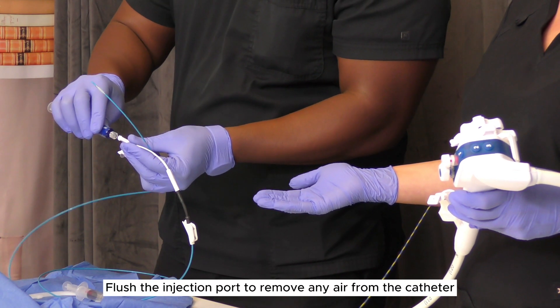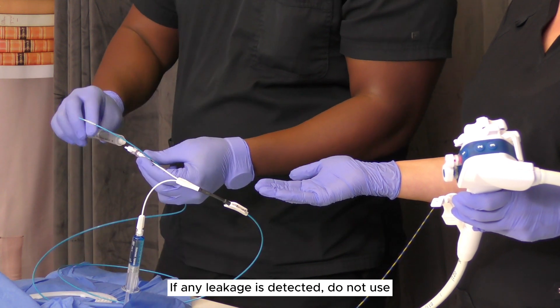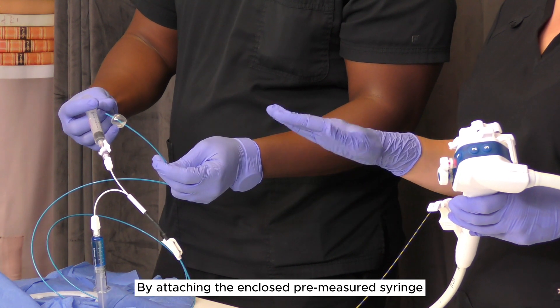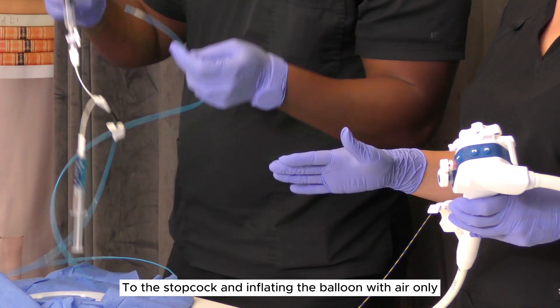Flush the injection port to remove any air from the catheter. If any leakage is detected, do not use. Verify balloon integrity prior to use by attaching the enclosed pre-measured syringe to the stopcock and inflating the balloon with air.